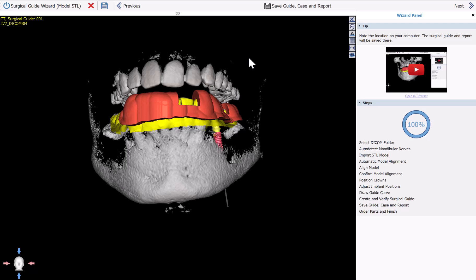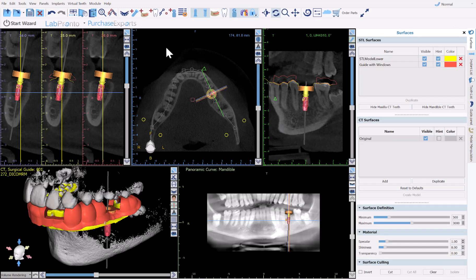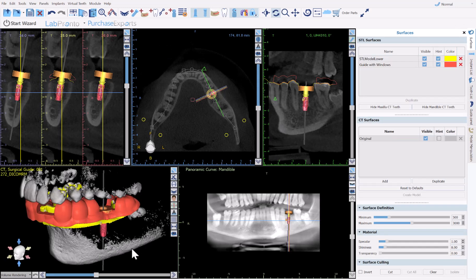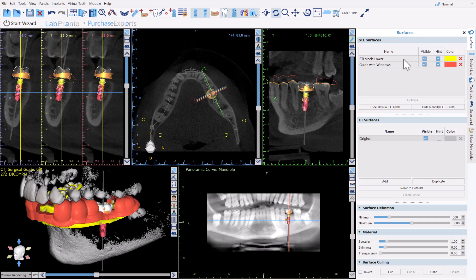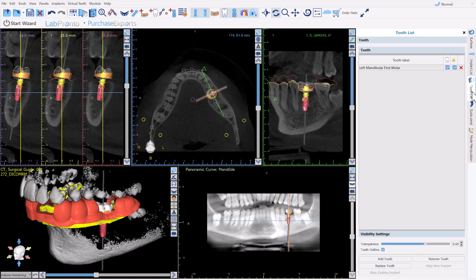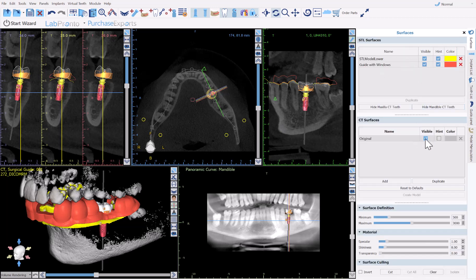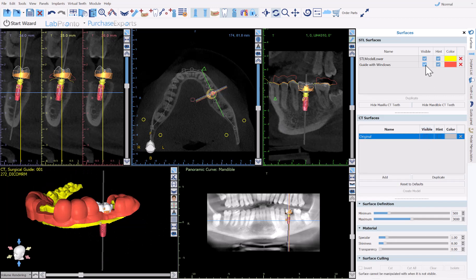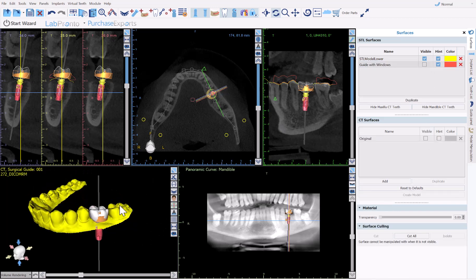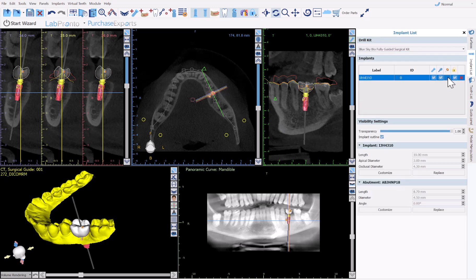Now that we have our surgical guide done, I'm going to X out of the wizard. As we saw during the process, the software designed a tooth for the case. If it's not visible, just click on the visibility for Show Teeth right here, or you could access it via the tooth list. I'm going to turn off the CT, surgical guide, and software guide tube so we can see just our tooth.